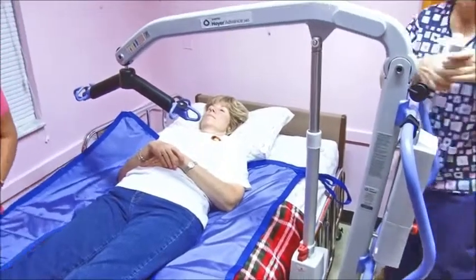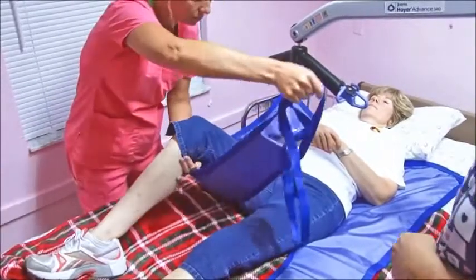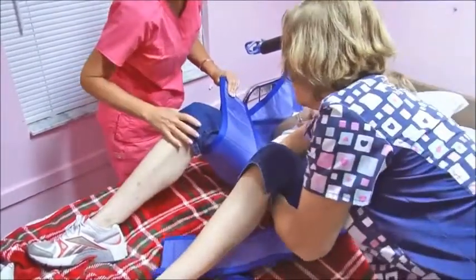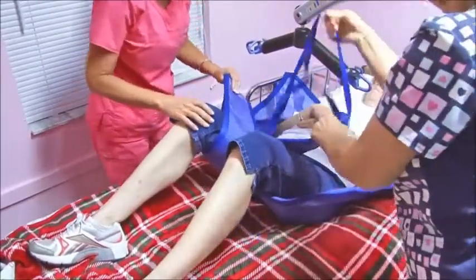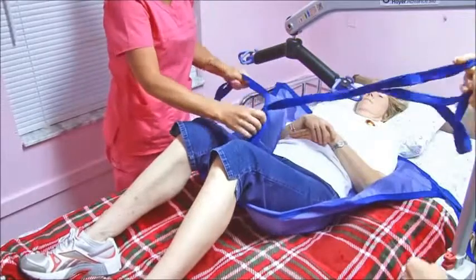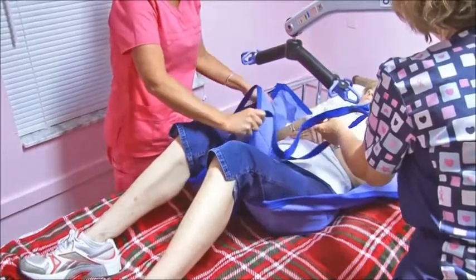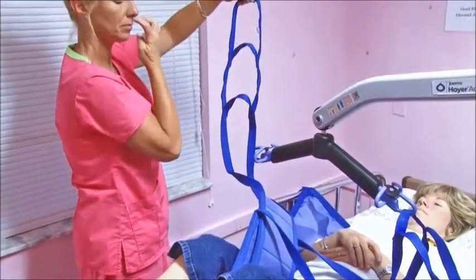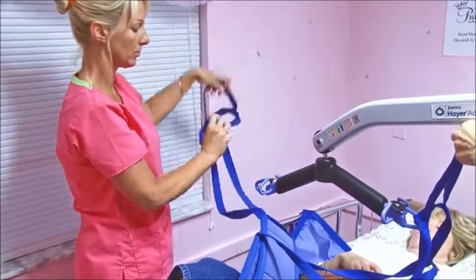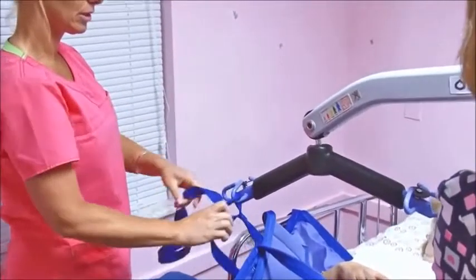You're going to wrap the leg straps around the back of the thigh. Lift the leg. And then you're going to go through, and each person has a crisscross. Okay. There's 3 loops, 1, 2, 3, that will eventually be color-coded so you'll know which color for each specific resident. I'm going to loop on to the bar, push down on the black tab, take a second, the middle one, and loop.